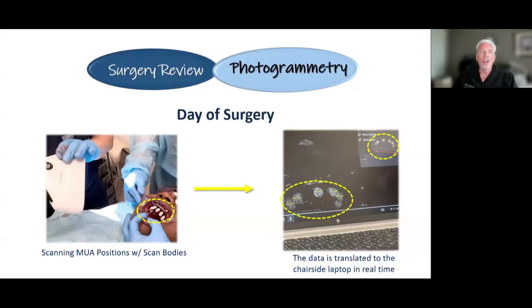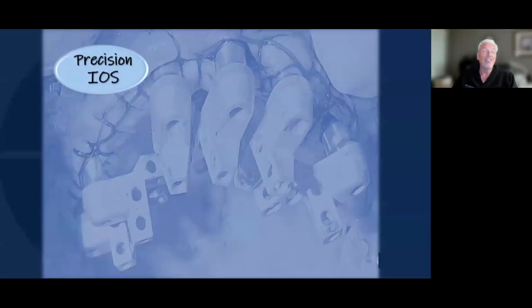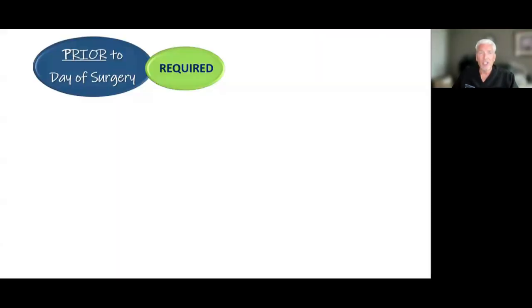They're not going anywhere. It makes it a much shorter procedure for them, especially if you're doing IV sedation. I've been doing more cases, it seems, than I have in a long time, in hospital situations in the OR, where we're really conscientious about being very effective with our time for the patient's safety, quite honestly. So let's talk a little bit about precision IOS now on the day of surgery.